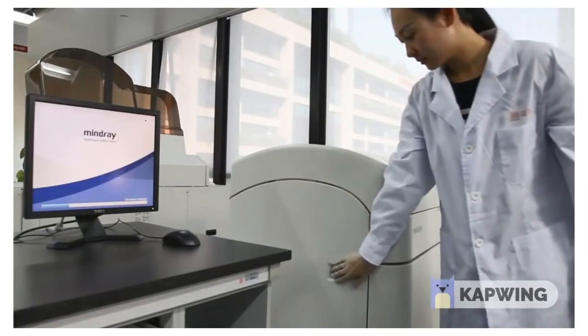So, I hope you appreciate the video. Di ba? So na-mention didto throughput, na-mention ang inyong mga wash solution, katong DI, that is your deionized water. Na-mention si ISE, that is your ion selective electrode, which is usually the method used for your electrolytes, di ba? Sila sodium, chloride, unsa pa ba to ang na-mention, or katong naay cooling system, si LIS. So gipili gyud nako ni na video kay at least medyo na-mention gyud niya ang mga na-discuss diri sa ato ang topic.